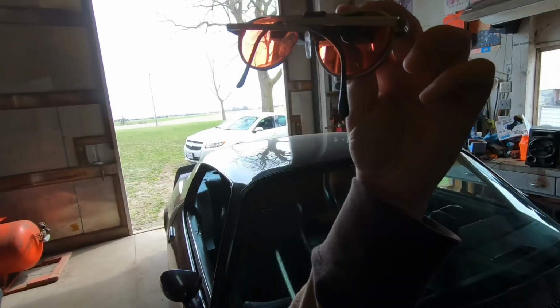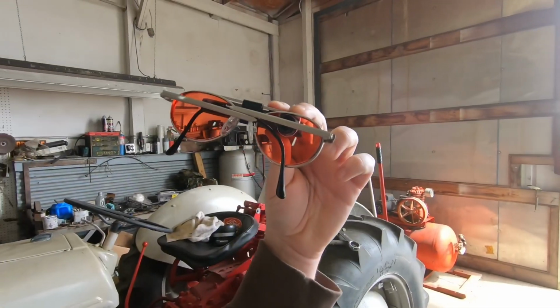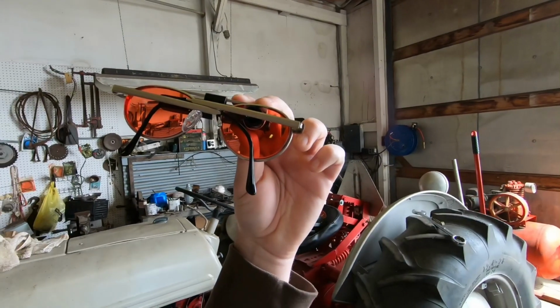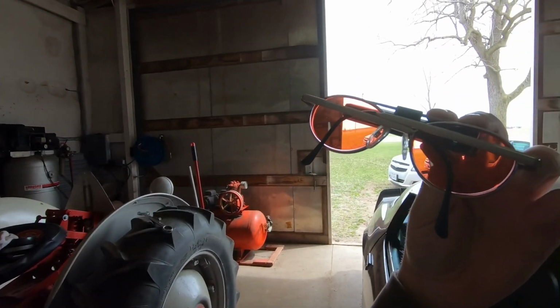and so the telescope comes down, and there's not really a good way to show it. I'll have to take pictures of myself with my cell phone to show a better picture. But you can see where the telescope comes through. Since the lenses are a little bit smaller, it protrudes a little bit farther down in the sight picture. That is the big con for me, because where I like to sit, my back's kind of hunched, so I like to lean the seat back and sit like this.